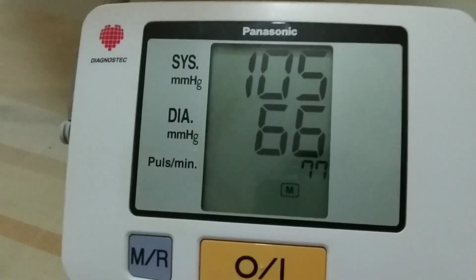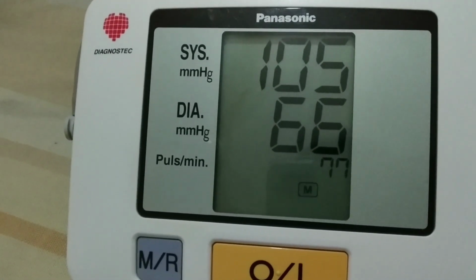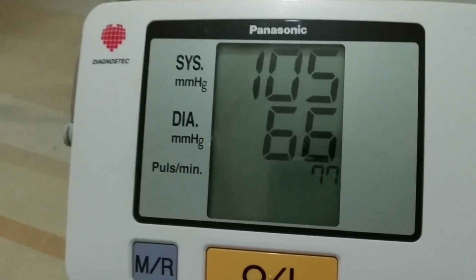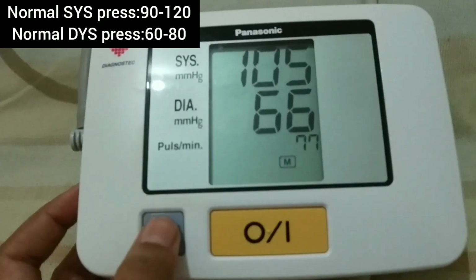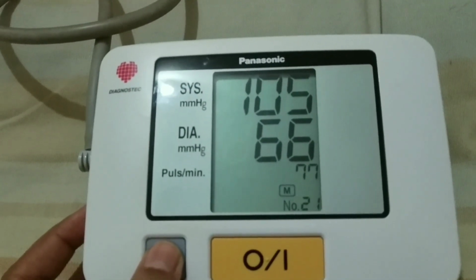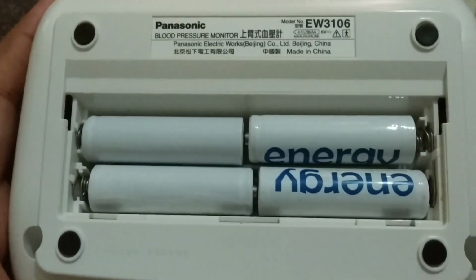The top number refers to the amount of pressure in your arteries during the contraction of your heart muscle, and this is called systolic pressure. And the bottom number refers to your blood pressure when your heart muscle is between beats, and this is called diastolic pressure, and this is pulse per minute. You can also save your previous readings, and these batteries are rechargeable and you can recharge it whenever you want.